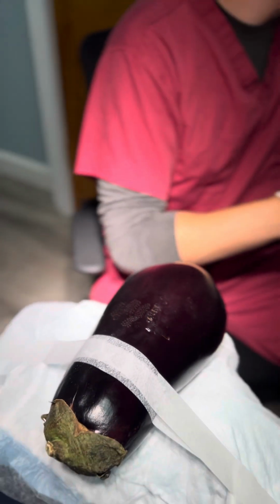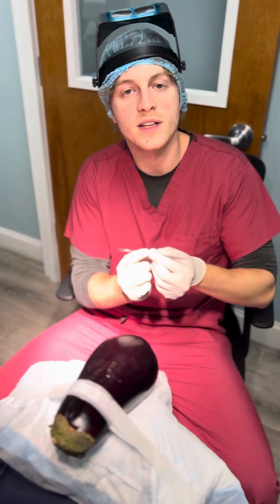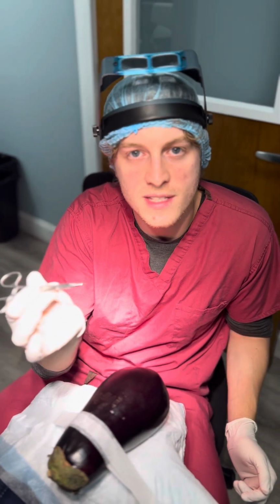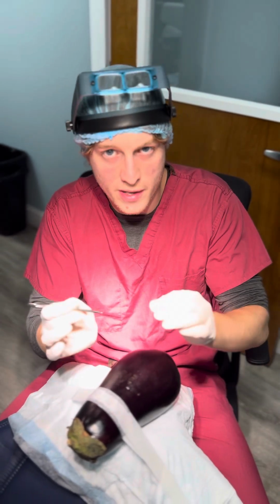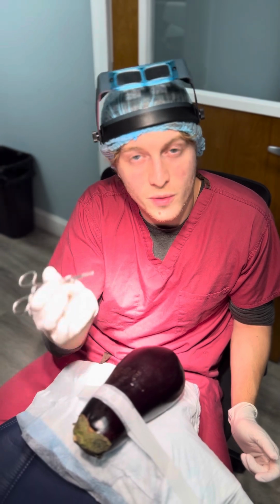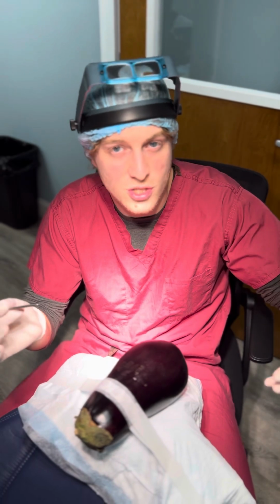And then if you look at the incisions that we made using our own custom cut blades. Now these blades are made using a special device that's quite difficult to get your hands on. Once we're cutting the grafts under the microscope, we take a look at the size, because the size of your grafts vary. One person might have very long and wide grafts, another person might have very small and narrow grafts. So we always customize our incision sizes so that the grafts slip into the incisions perfectly.